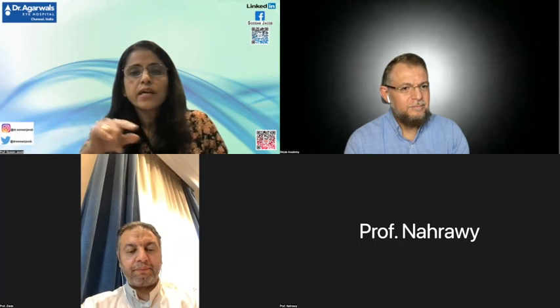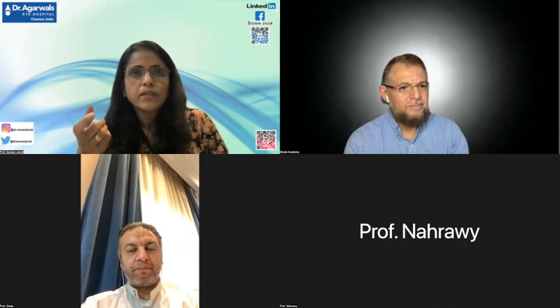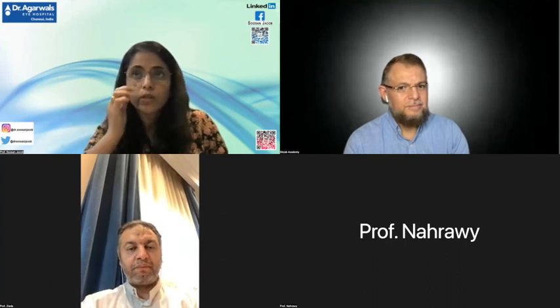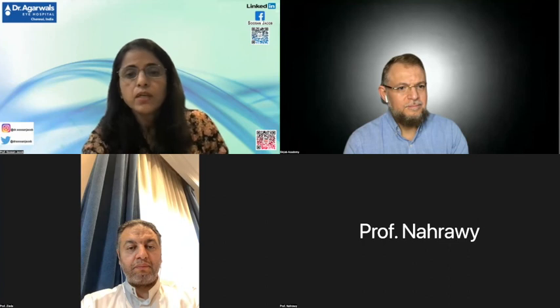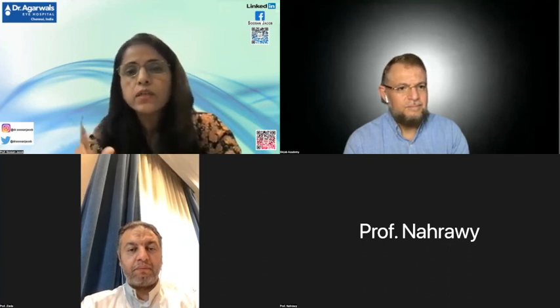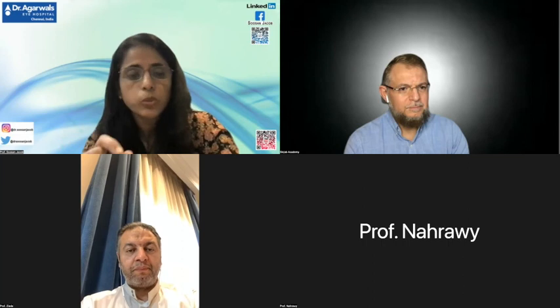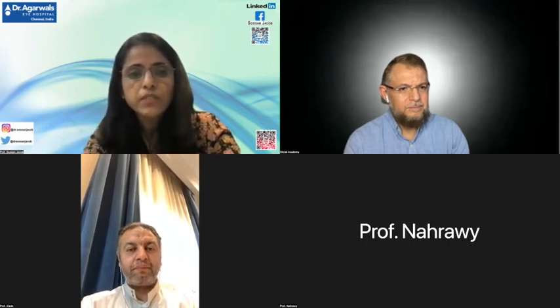So it's too early for me to say, that number is too small for me to be able to really say what is happening there. And some of them are just very recently done. In fact, one patient just got both eyes done. So our CAIRS with cross-linking patients do very well. The stability continues to remain well. The segment thickness also doesn't change much for the limited studies that we've done. It continues to remain the same, which is really very encouraging.